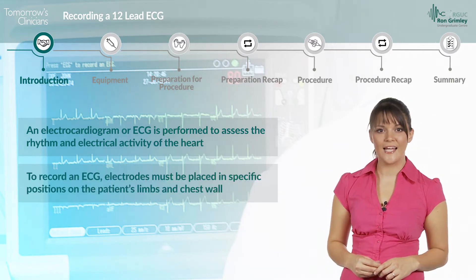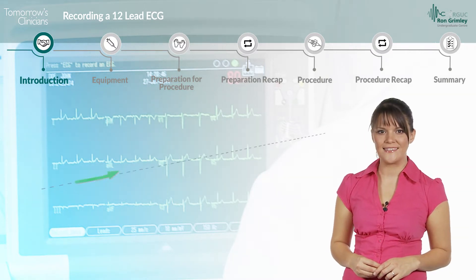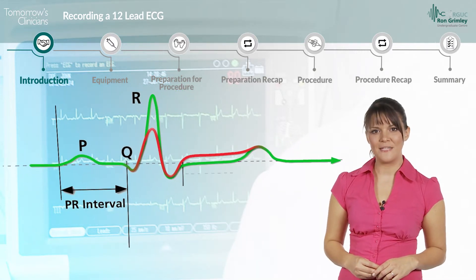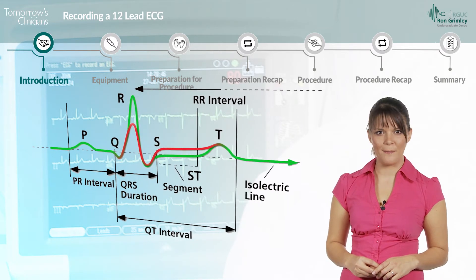To record an ECG, electrodes must be placed in specific positions on the patient's limbs and chest wall, then connected via leads to an ECG machine, which records the electrical activity. The ECG machine produces a trace, which must then be analysed by a qualified member of staff.